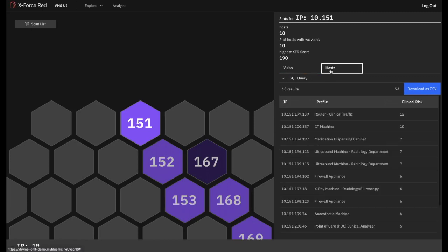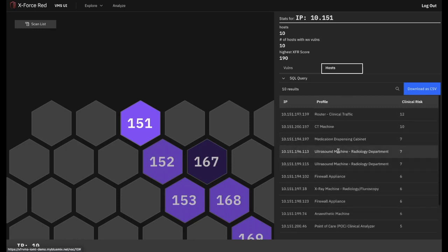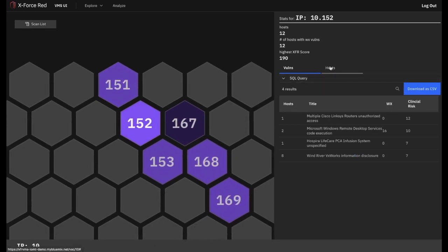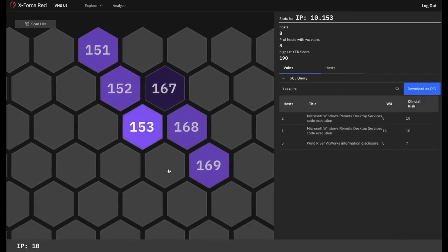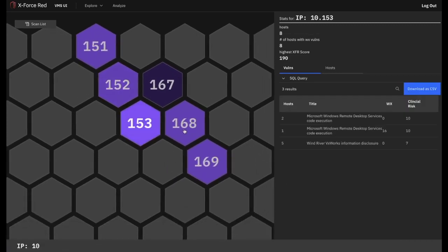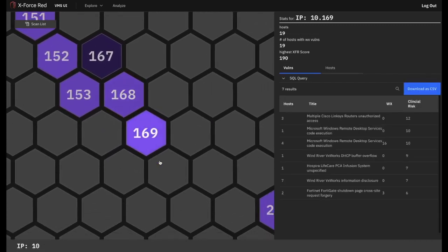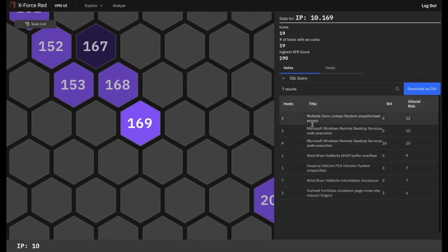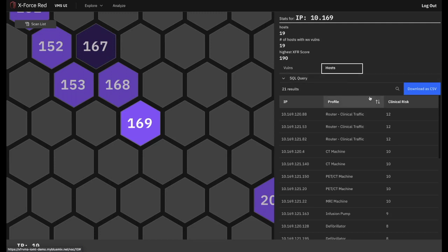In addition to the rich vulnerability data, we can start looking at the types of hosts or assets that are being affected as well. As we move through the different hexes in this cluster, we once again review the vulnerability and host information until we reach 10.169, which contains a higher number of assets and clinically concerning vulnerabilities. 10.169 also has a high variety of IoT devices that could potentially be compromised, ranging from routers relaying clinical traffic through to imaging devices, defibrillators, specialized imaging for nuclear medicine, and plenty more.